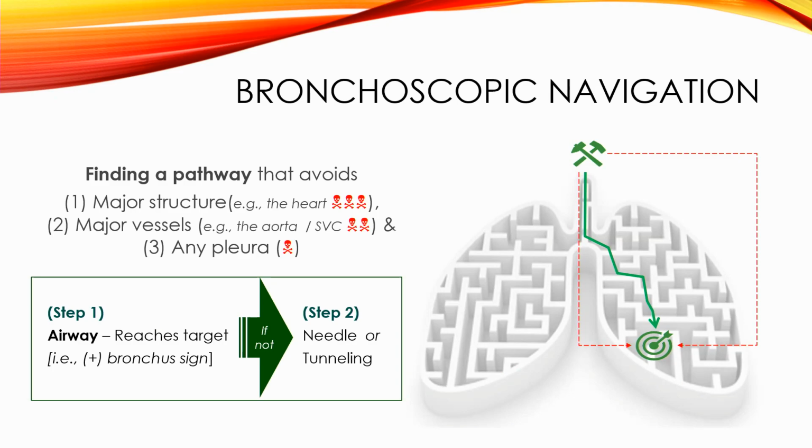It's just a name. The important message I want to get across from this slide is that this is just two steps of the same process. It should not be treated as two separate techniques that you have to learn, and operators should not be too apprehensive towards this last step. If we want to have a full access to all the nodules in the lung, this is part and parcel of what we have to do eventually.